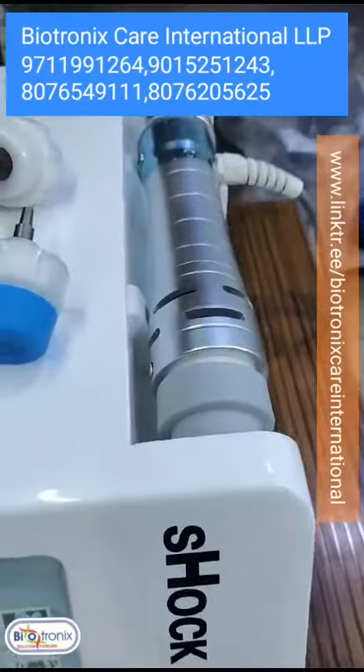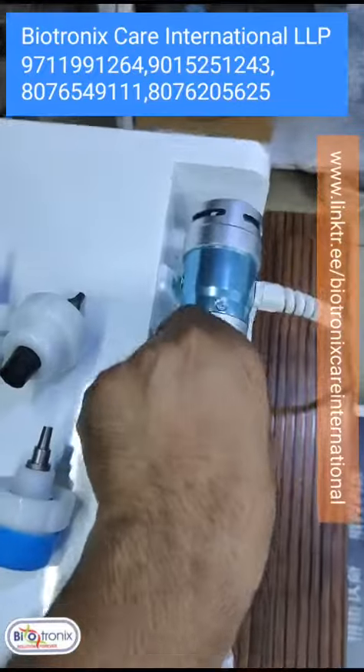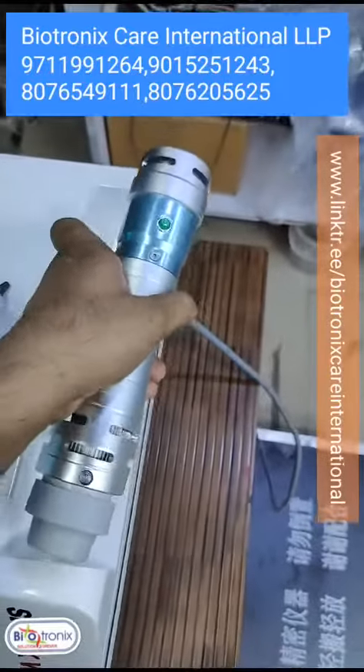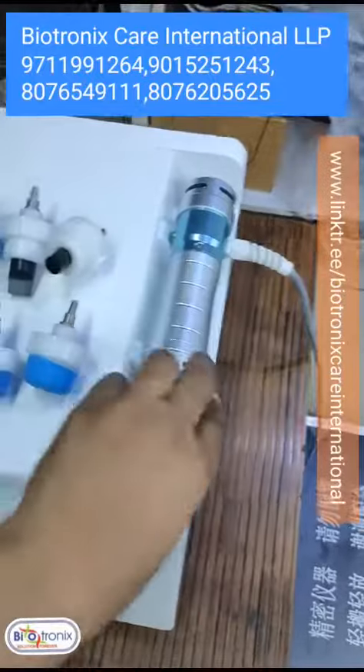This is the handle. One of the good things which I have observed from the previous model is that this has a switch in the handle only. So you press the switch and the handle will start working. In front of that there was a paddle switch, but you can use this handy version instead.